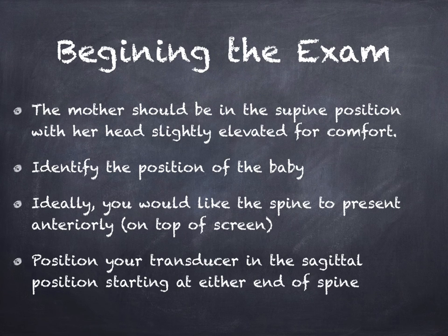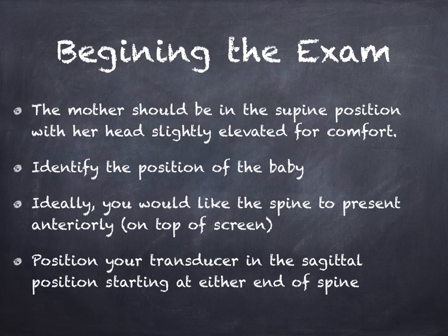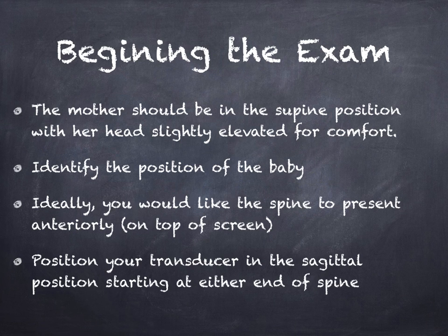Now we're ready to begin the exam. Have the mother comfortable before you start, and ask her if there are any problems with the pregnancy. Once the patient info is verified, start at the lower uterine segment to identify the fetal position. We need to have the spine up in the anterior position to get diagnostic images. Once you have that optimal view, begin at either end — the sacral or the cervical spine.